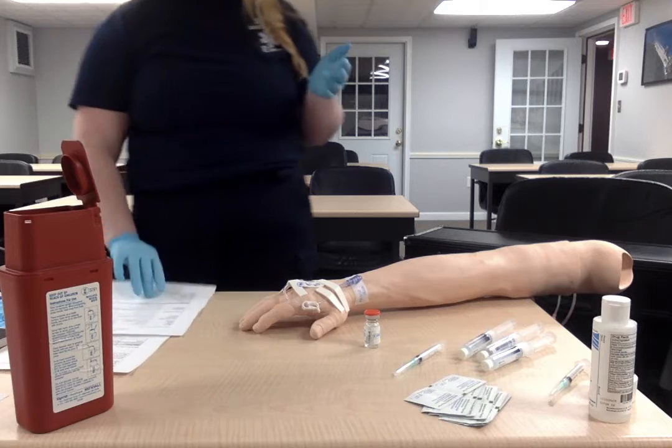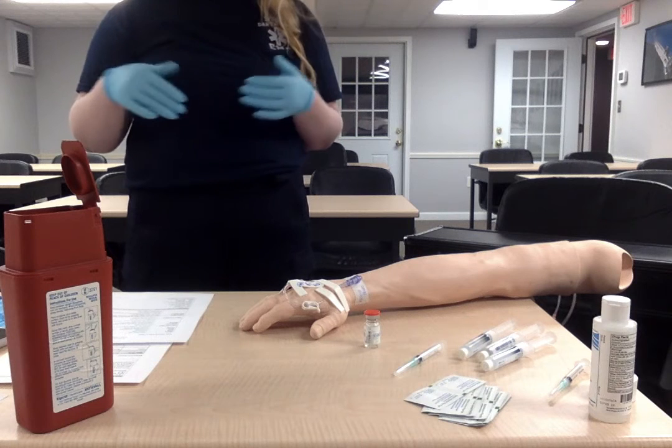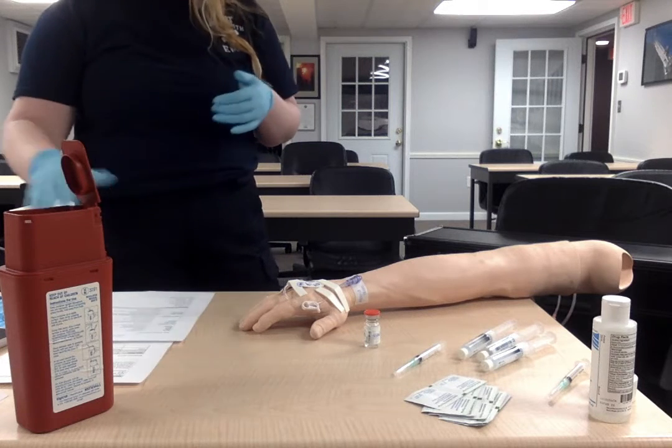We start with checking our order. So we have our order from the doctor that says Mrs. Edwards is supposed to get the bumetanide 0.5 milligrams IV push over 60 seconds at 5 o'clock, which is the time that it is now. So we checked our order.